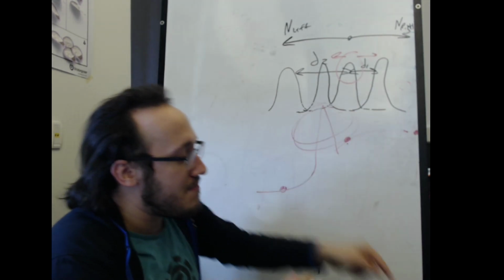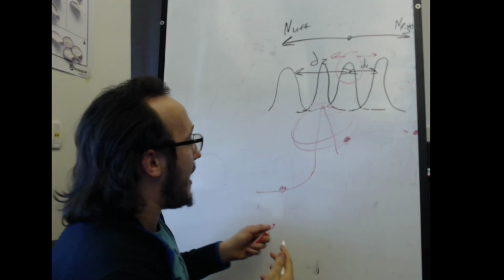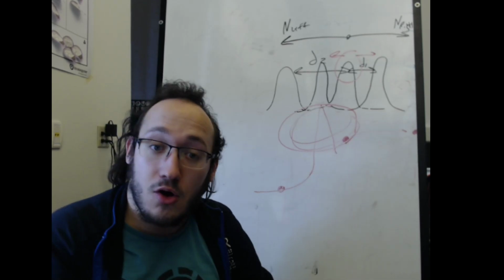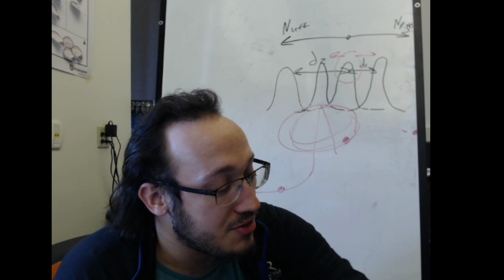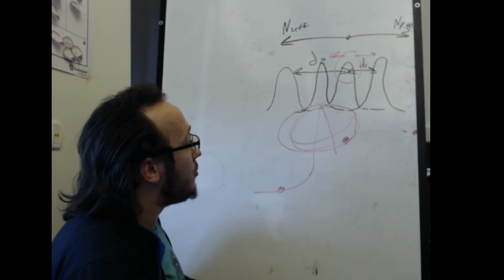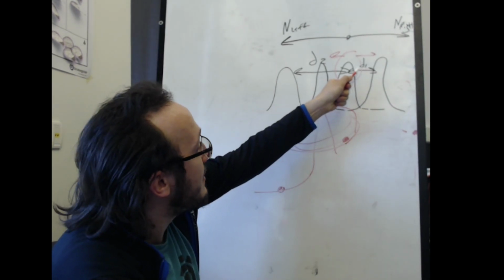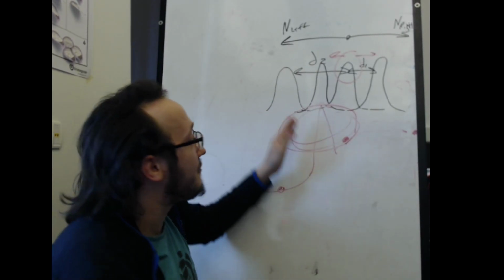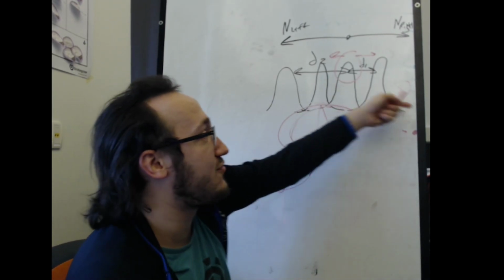This gets completely missed. And so the problem is that we cannot actually identify this particular aspect of the signal, and there's no way for us to know whether our signal is classifying based on the quality of our data, or if it's because it's not properly shifted. So the only way you can do this is you can test different values of this distance, and you can actually use different distances for your shifts if you wanted to. You don't have to use equal distance shifts. But you can also choose to have more shifts forward or backward.